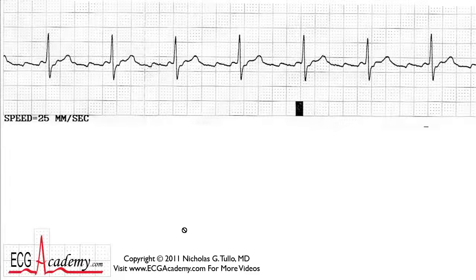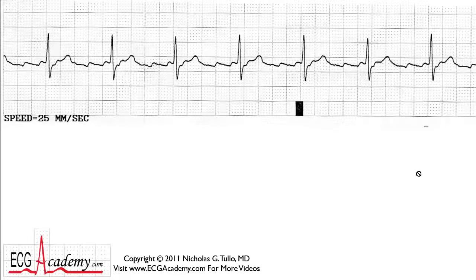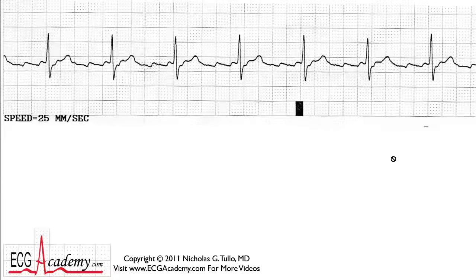This rhythm strip is something I found on the telemetry unit, and it's a very common strip — a common arrhythmia — so I listed it as basic. But it doesn't exactly look like the typical textbook picture of this particular arrhythmia. That's why I thought it would be fun to go through it step by step and teach you how to recognize this arrhythmia while you're looking at strips on the units.